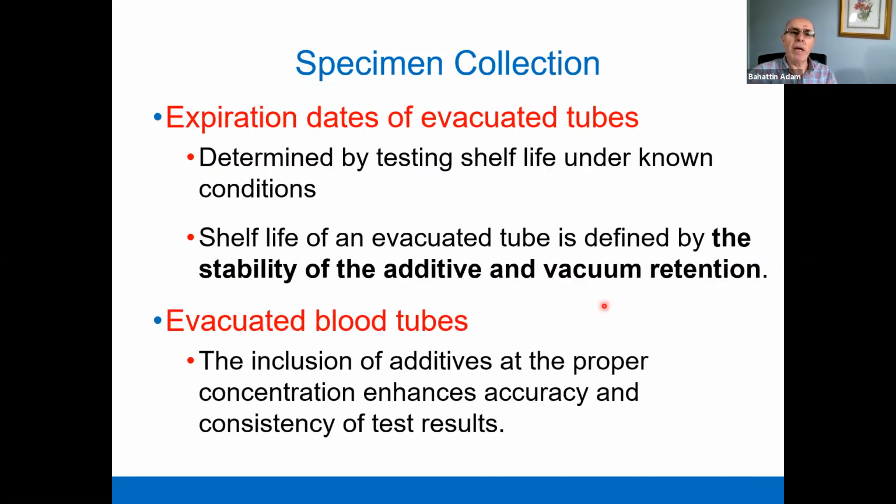And also the expiration dates of evacuated tubes need to be known, because the shelf life of the evacuated tubes is defined by the stability of the additives and the vacuum retention.